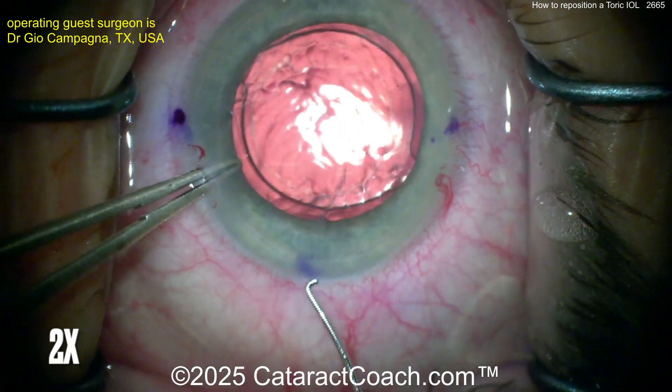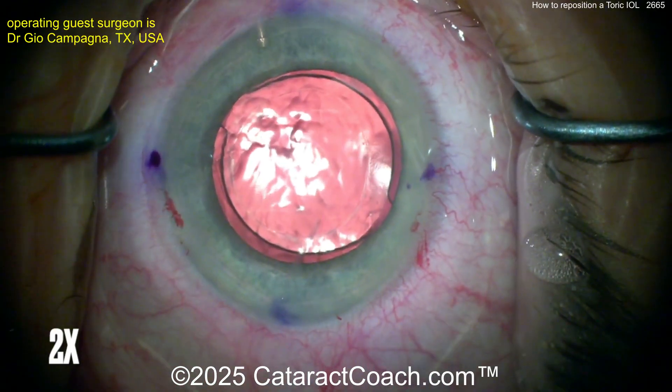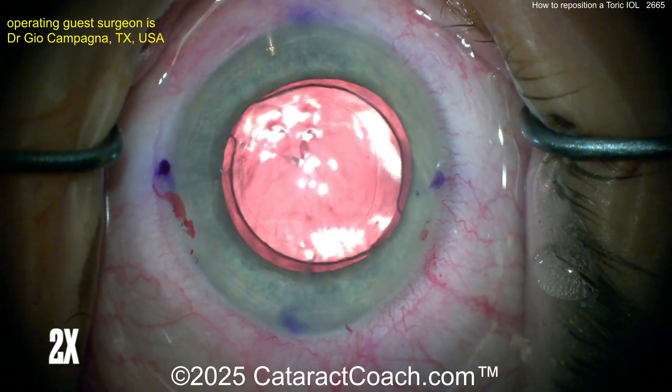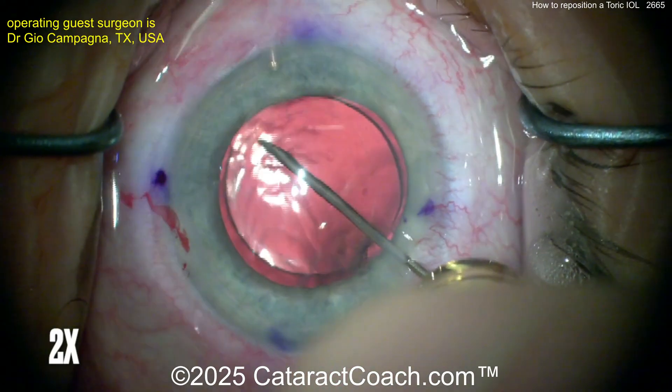Remember the shape of the haptics and the orientation. You need to have this lens first freed up from the capsule bag. You can see the surgeon open up the main incision just with a Sinsky hook. Remember, if you make these totally avascular incisions, even months later, even a year later, you can open them up with just a Sinsky.